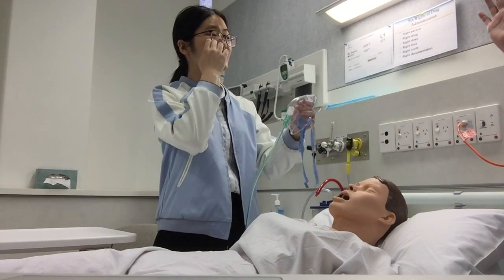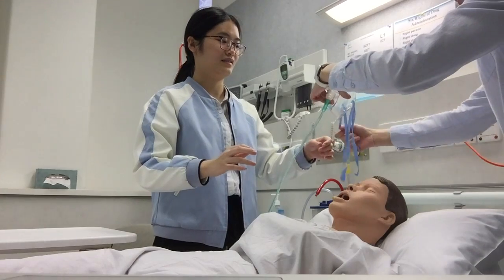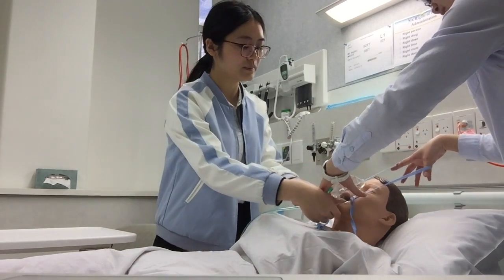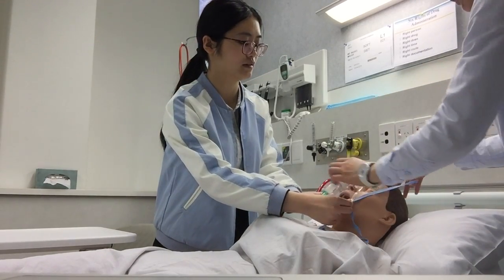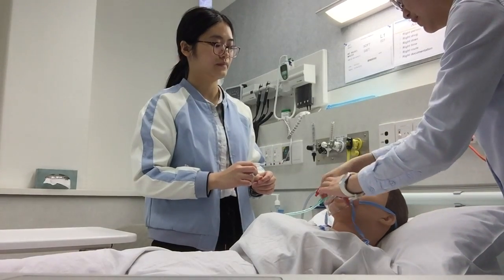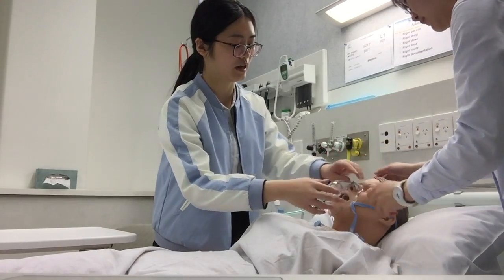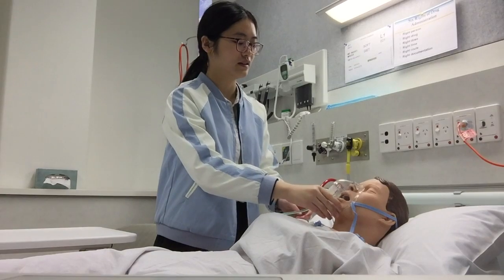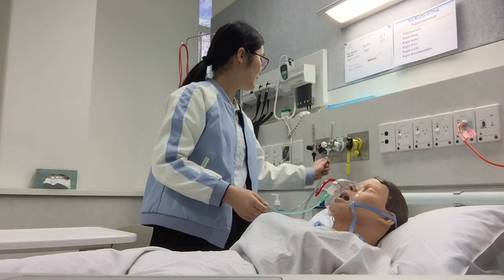Can I try? Yeah, you can try to put it on. Just put it over the mouth. You need to make sure it's comfortable for the patient. You need to ask him. Just make it fit enough for the patient and make it secure. And then we connect with oxygen.